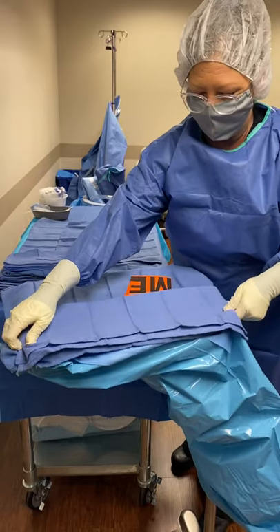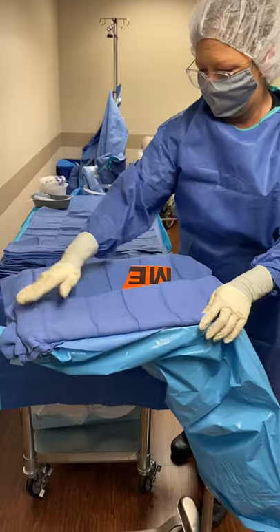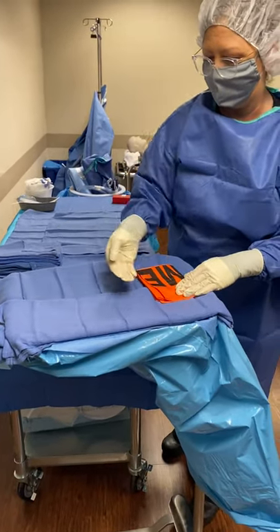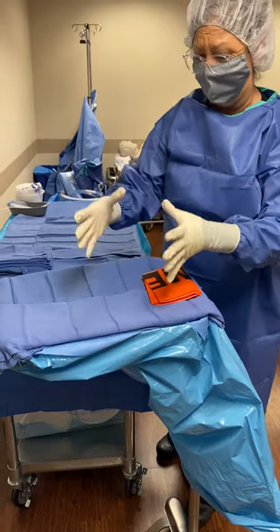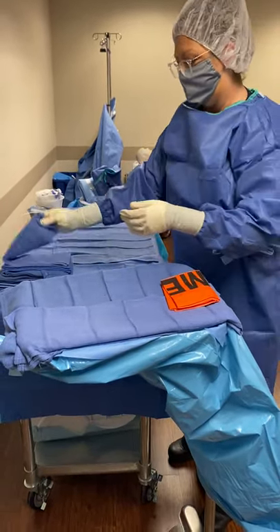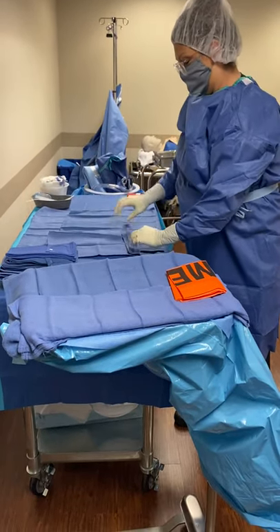This is how I like to set up my mayo stand — by having a half sheet here to tuck my instruments in. I like mine to lay flat as opposed to having them sitting up on a rounded towel. But I do like them on a rounded towel on my back table.